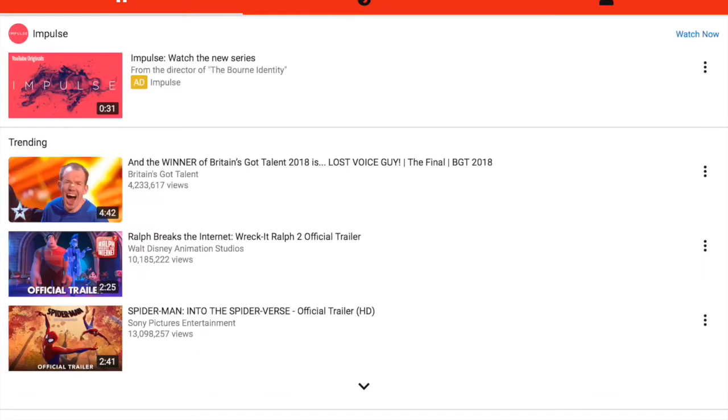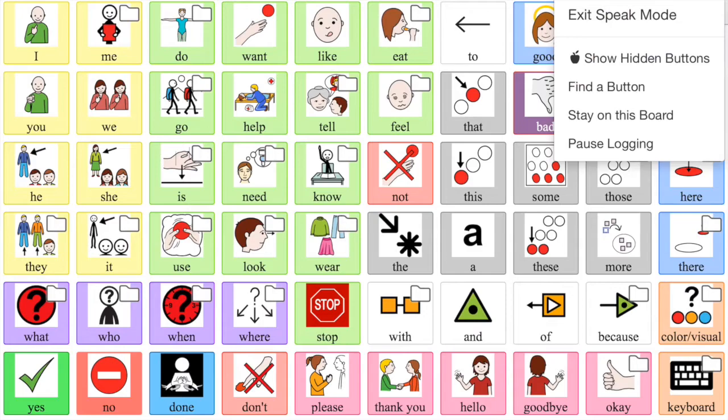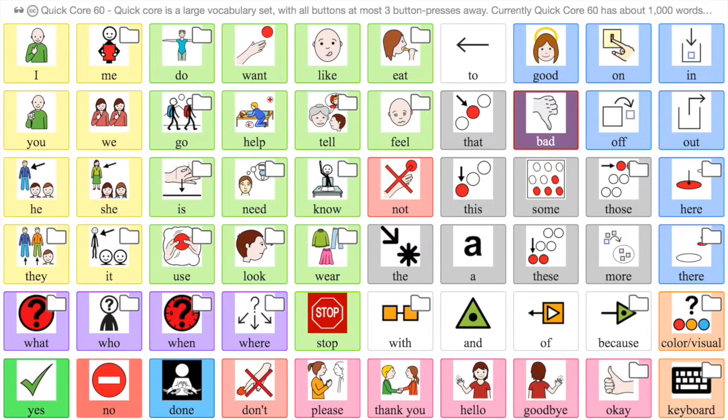There it is. So let's see, there it is, and it opened straight up to YouTube. So you could do this opening up to any website that you wanted a child to open to. I think you can also open to some applications. So we will look at that.